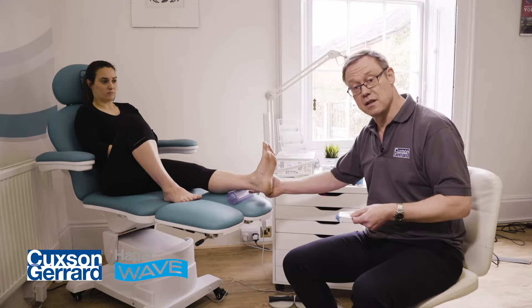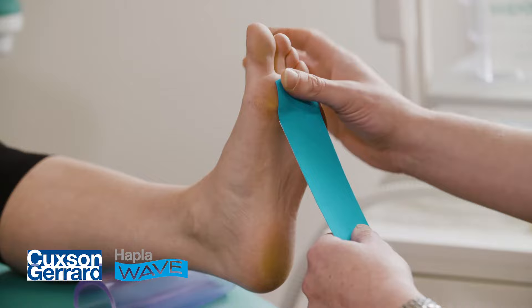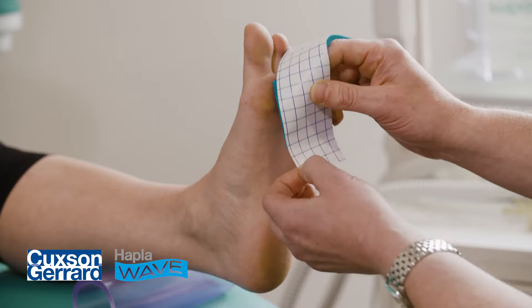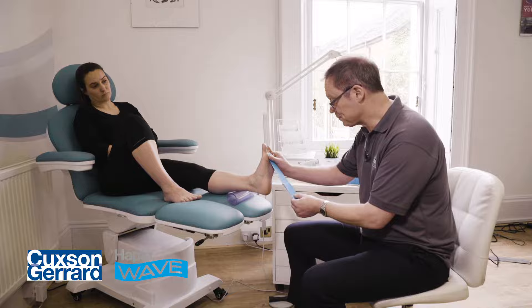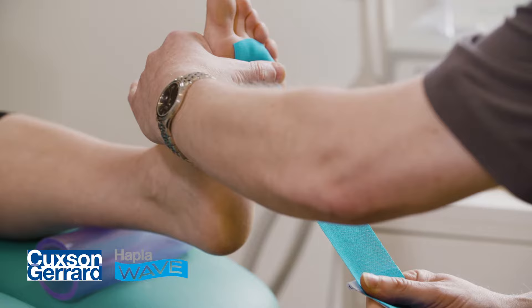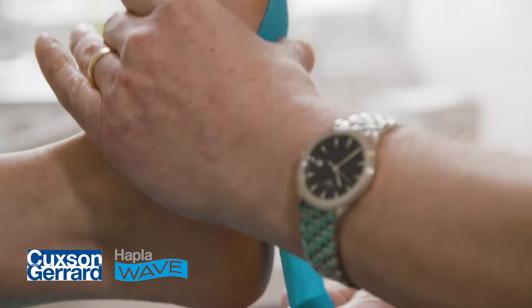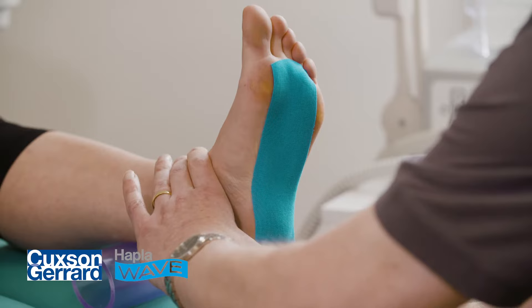Let's establish the anchor point on the plantar aspect of the foot, just over the central metatarsal heads. Then we peel back the paper backing. A little bit of tension on the tape just to free that edge of the paper. We're not going to peel that paper all the way back, because we're going to establish the first anchor point first, then as we go over the heel we're going to change direction. 100% stretch would be pulling the tape all the way, but we want 50%, so we're going to come back by about half. Then we're going to lay this along the central band of the plantar fascia, keeping good skin contact. As you come down, make sure you push down on that tape right onto the skin so it adheres strongly. Then we get to the plantar aspect of the heel — there's our first part.